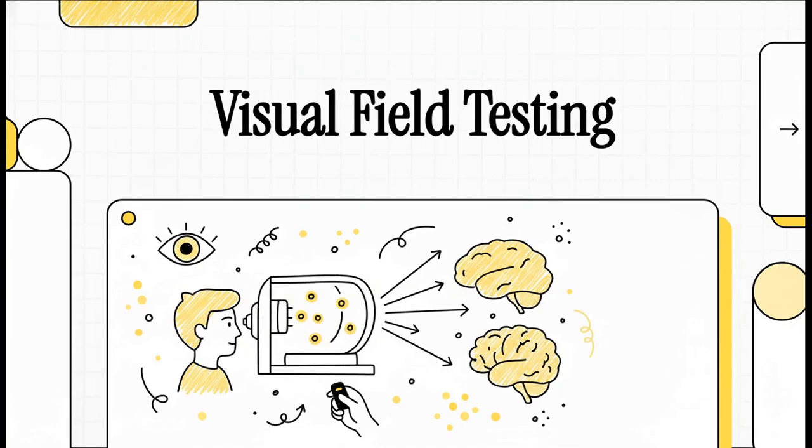You've probably done it before, right? You sit in a dark room, you stare into this strange-looking bowl, and you click a little button every single time you see a flash of light. Now, it feels kind of like a simple, maybe even a little tedious reaction test. But what if I told you that that simple test is actually creating a super sophisticated map of the connection between your eye and your brain?